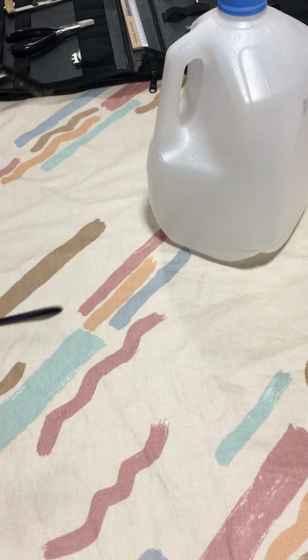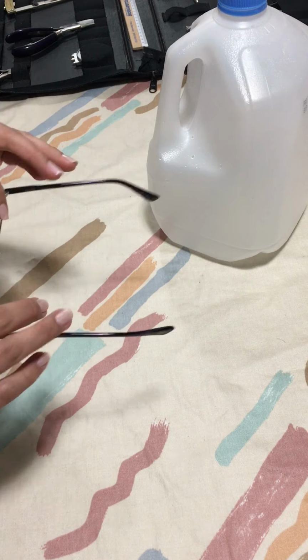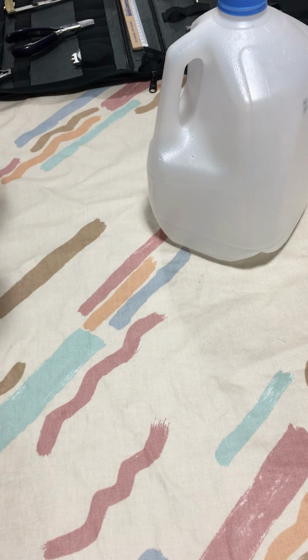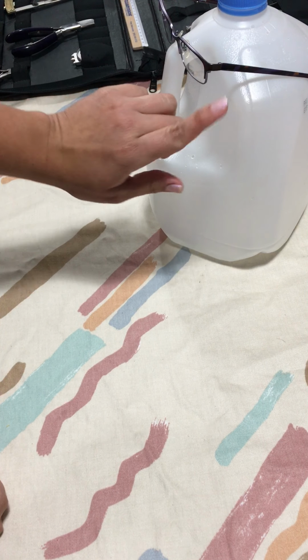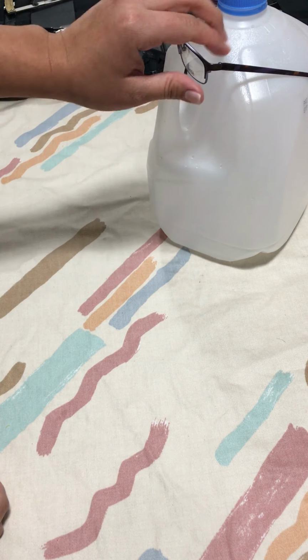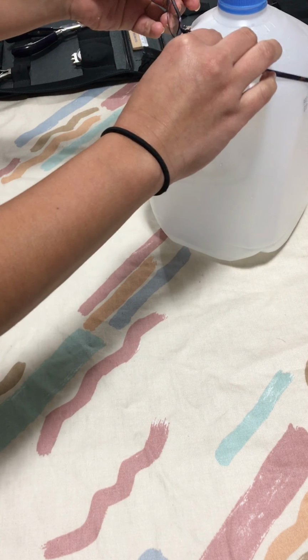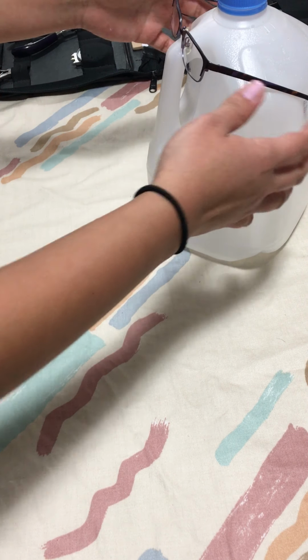On the pantoscopic tilt as well, I noticed that the patient needed it because it was almost touching the cheeks here. If the cheeks would have been here on the patient, it would have been touching on the cheeks. So just to demonstrate that, I will demonstrate it right now. So if this was our patient, the cheeks right here would have already been touching, and that's why I removed the pantoscopic tilt, and the patient still has pantoscopic tilt, but it doesn't have as much pantoscopic tilt.